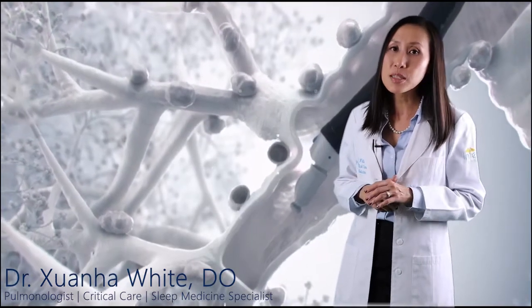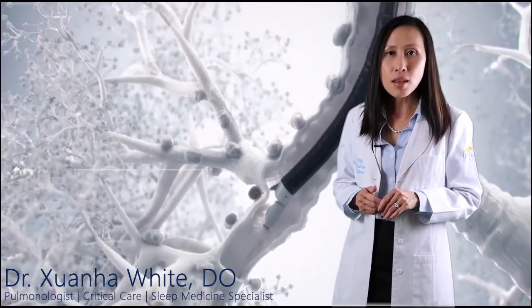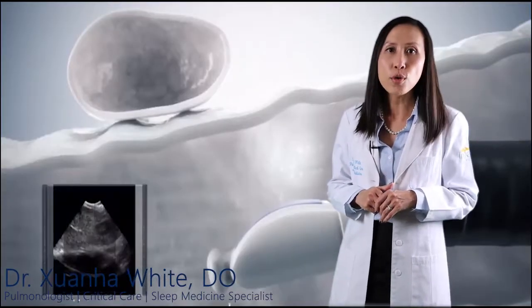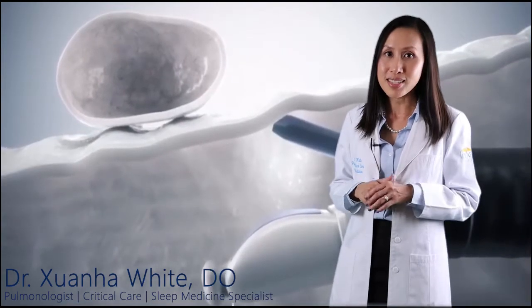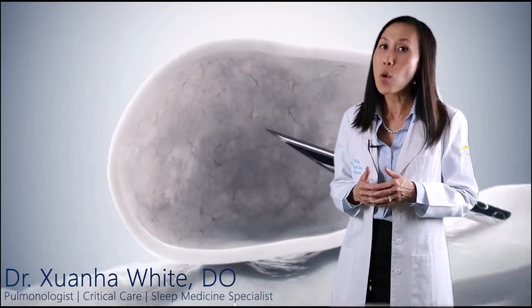An ultrasound monitor displays real-time images of your airway, blood vessels, lungs, and nearby lymph nodes to guide me to the right location. I then push the needle through the bronchial wall from inside to take samples of cells from the lymph nodes or other tissues in the area between the lungs called the mediastinum. The samples can be examined to diagnose lung cancer or other diseases.